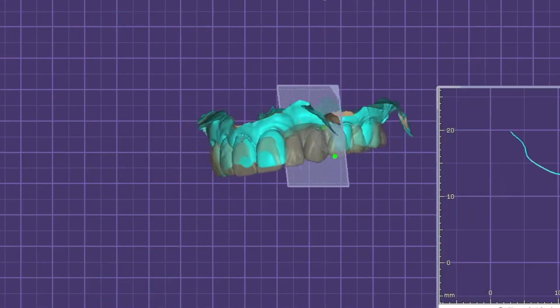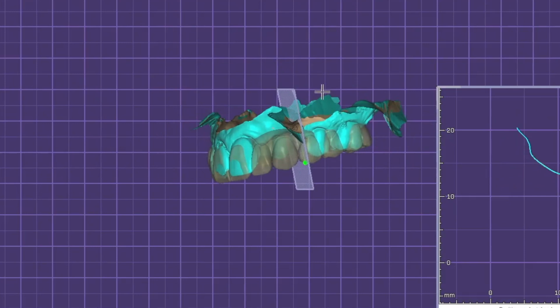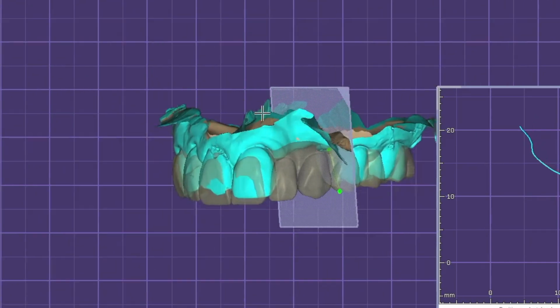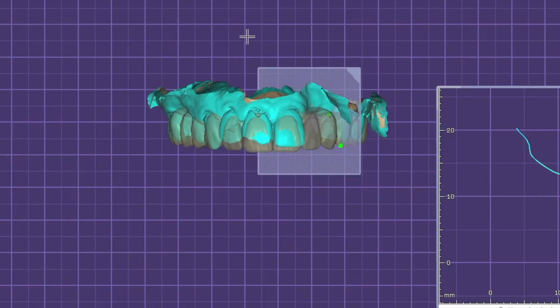So we've got this pre-design overlaid, and I'm taking these, what I call a cut view cross-sectional measurement. And I come in here and go, hey, from the healing cap alone to the proposed position, we have 11.486 millimeters of room. If the healing cap, let's say, is 3 millimeters, I think I've got enough reduction where we can have a prosthesis that'll be strong enough, 12 millimeters in height, that we can use these implants rather than cause such damage. You know, when you're removing an implant that is in bone, those implants are stable. And so I would rather choose to load those 2 implants and add 3 or 4 existing implants around that than create that destruction of the bone trying to remove those.